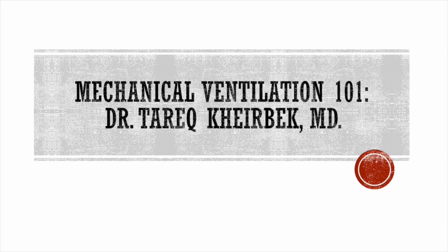If we want to make the math easy, I'm shooting for a tidal volume of 450 mLs with a minute ventilation of 9. Then my respiratory rate that I want the patient to breathe at will be around 20. So my settings for ventilation will be setting either a tidal volume of 450, a rate of 20, a FiO2 of 100%, and a PEEP of 5 to 8, depending on what I think the oxygenation level is initially.